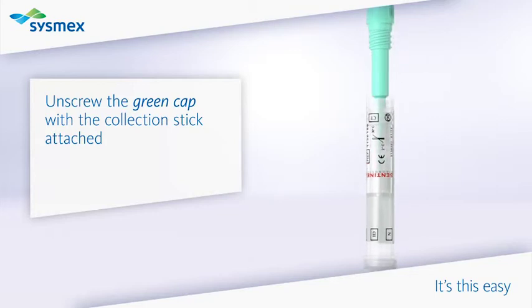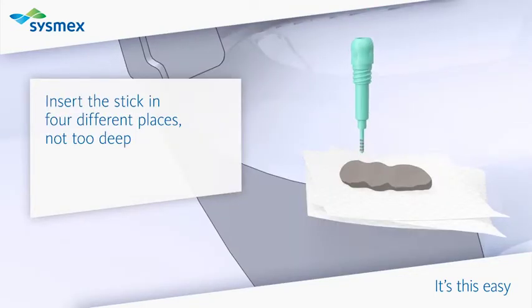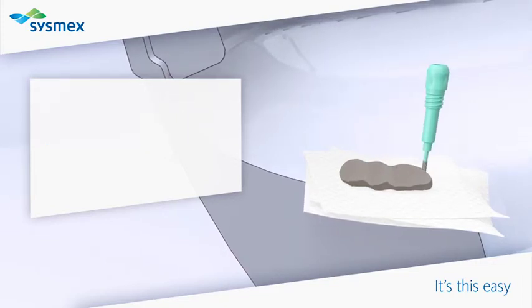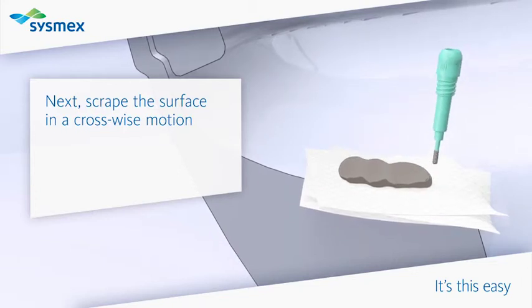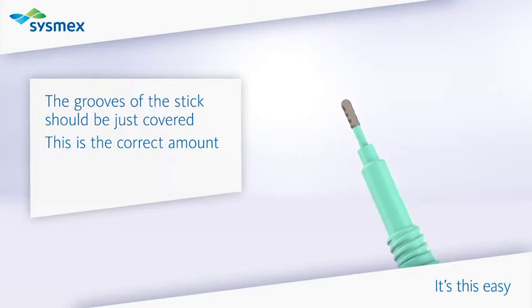Unscrew the green cap with the collection stick attached. Insert the stick in four different places, not too deep. Next, scrape the surface in a crosswise motion. The grooves of the stick should be just covered. This is the correct amount.